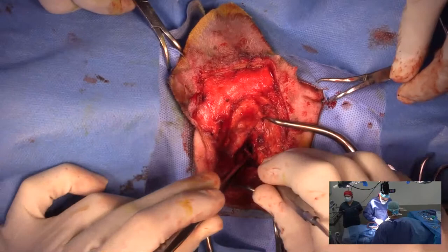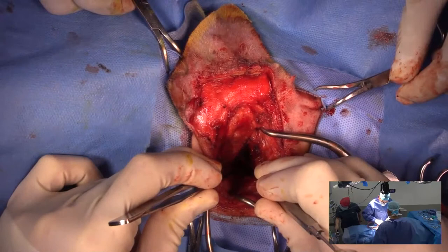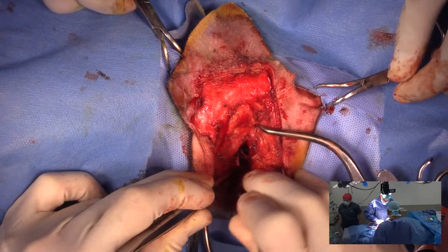There's a question, what breed of dog is this? It's a West Highland White Terrier. Which also has a reputation for having at least skin problems, if not ear canal problems. So I'm right here, I'm ventral to the bulla. And now that I've got that exposed ventrally, facial nerve is sitting right there.